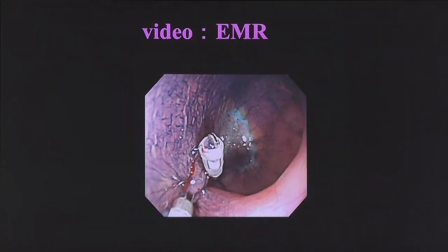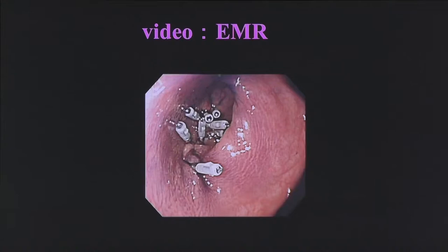And sometimes I suture the wound after EMR. Not always.